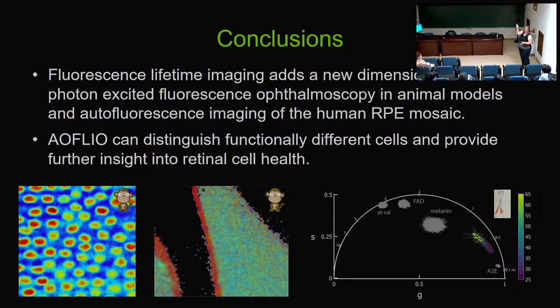Melanin, that's just one type of melanin, and it's a melanin we were able to purchase. It does not guarantee that it's exactly the same melanin that is in the RPE. So these are representative of where we think things are happening, but with that, we think it's the increase in melanin and the presence of melanin within that, and that's consistent with ex vivo results that have been done in histology. Thank you.